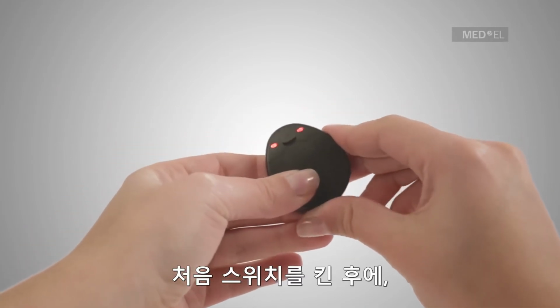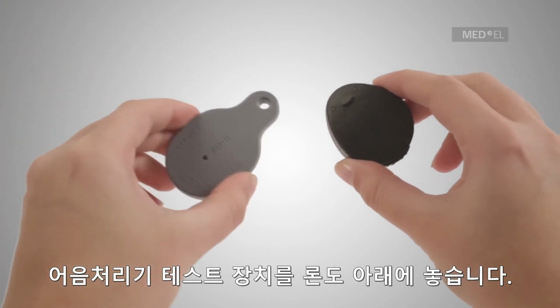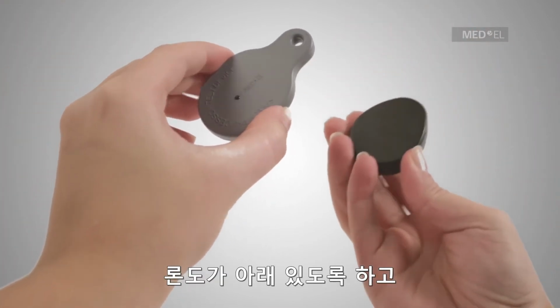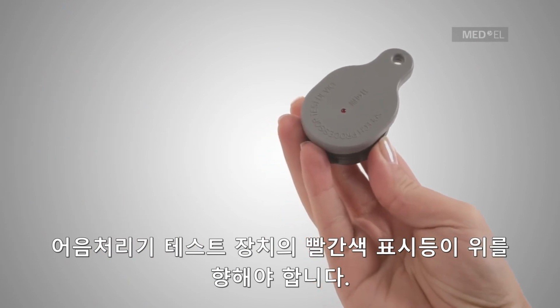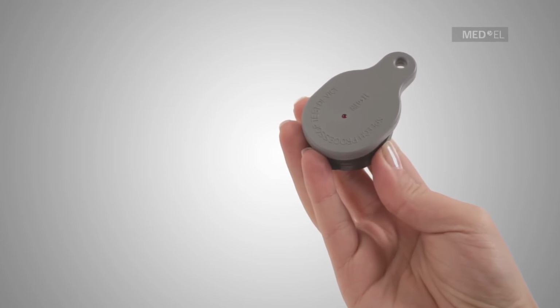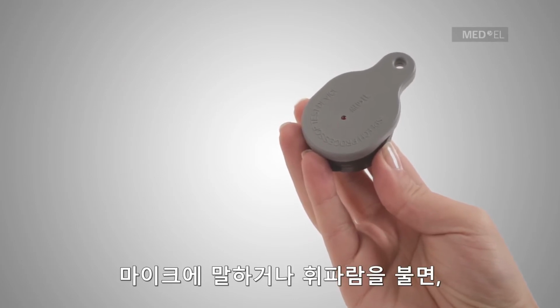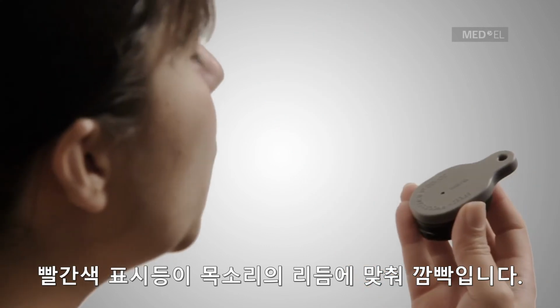After first switching it on, place the RONDO underneath the speech processor test device. The RONDO should be upside down, and the red indicator light of the speech processor test device should be face up. When speaking or whistling into the microphone, the red light should flicker in rhythm with your voice.